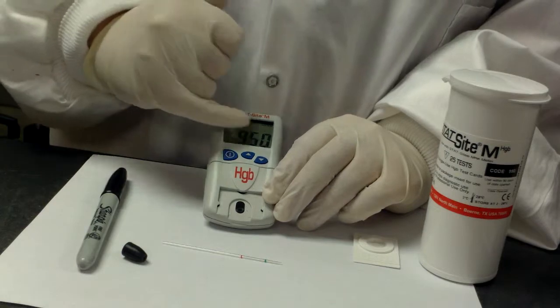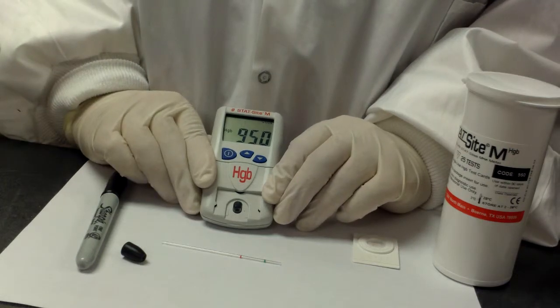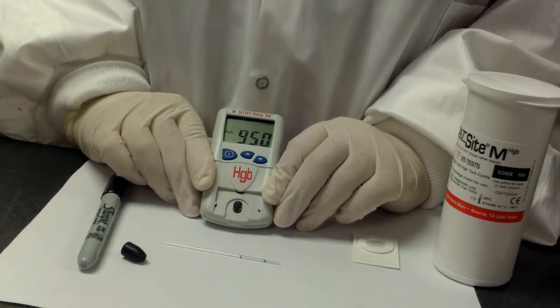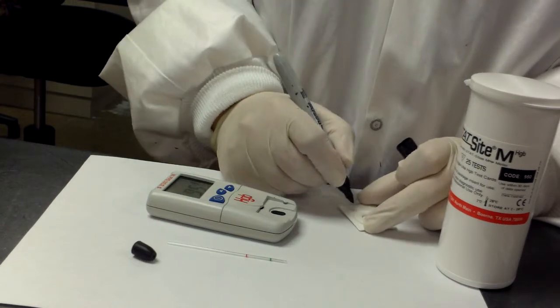Okay. You can see the code is 950, and that's the code that's on our canister, so we're good to go. Like most of our point of care testing, this has got idiot instructions. It shows you that it wants you to put the little strip in. So what you're going to do is you're going to label it with your patient name.